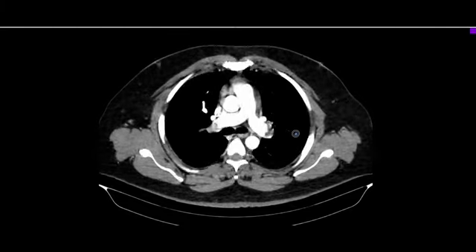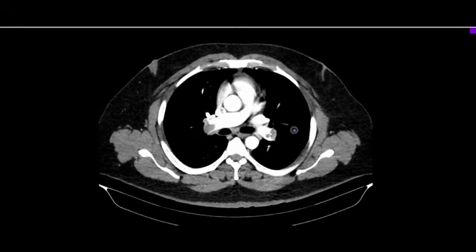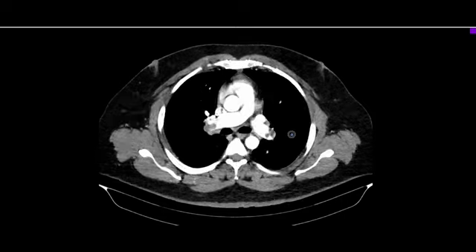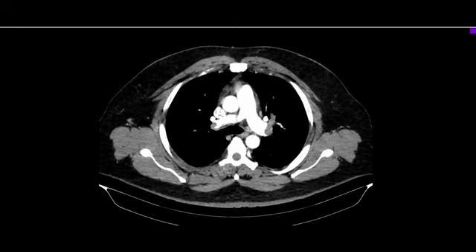So we are done with spatial classification, temporal classification and hemodynamic classification, giving the clot load score and percentage involvement. Other vascular signs: sometimes you can see findings of pulmonary artery hypertension because there is occlusion in the arteries, so there will be raised pressure in the pulmonary arterial system.